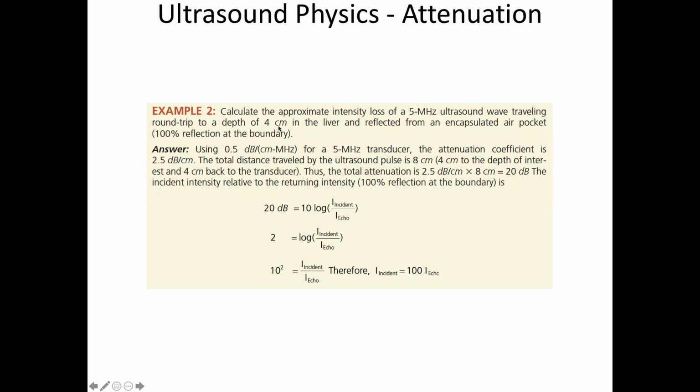And it's down at 4 centimeters. So the round trip is 8 centimeters, right? So that wave, when you ask, well, how much is it going to have decayed through just loss of energy? You have to take it through 8 centimeters to do that.